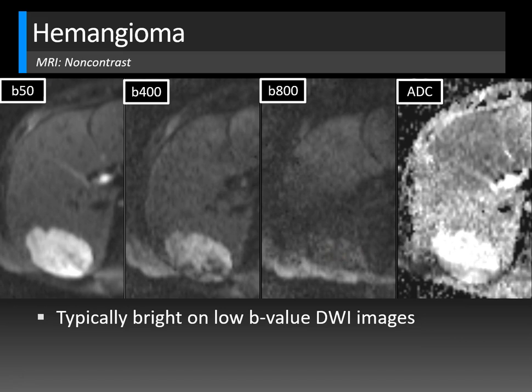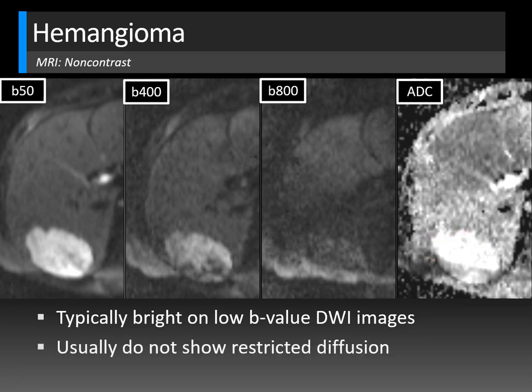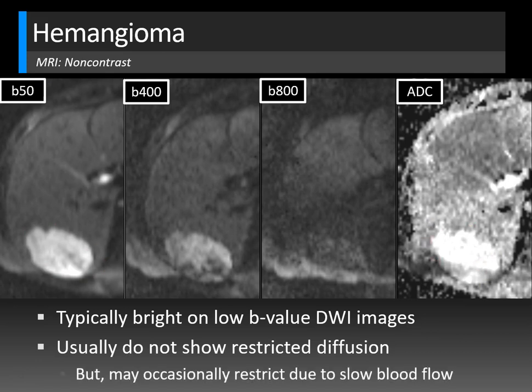The ADC sequence is independent of T2 weighting. Lesions that restrict diffusion will be dark on ADC, while those that don't will be bright. A typical hemangioma does not restrict diffusion — it's bright on low B-value and bright on ADC. Occasionally you may see hemangiomas that do restrict diffusion due to slow blood flow within the lesion, showing small areas of mixed restricted diffusion, but you shouldn't see severe diffuse restricted diffusion.